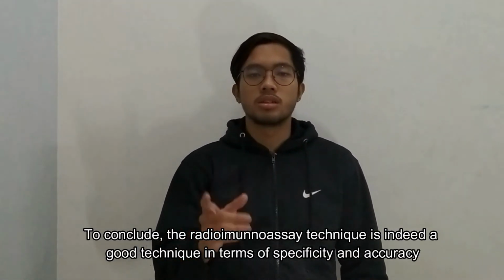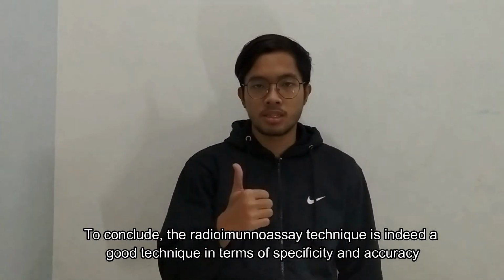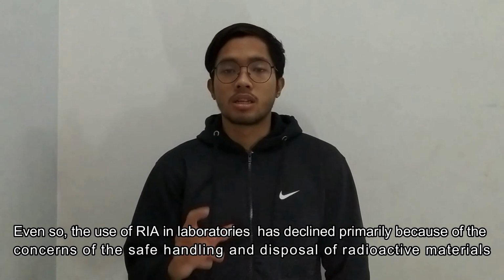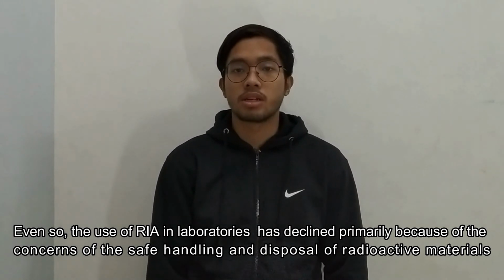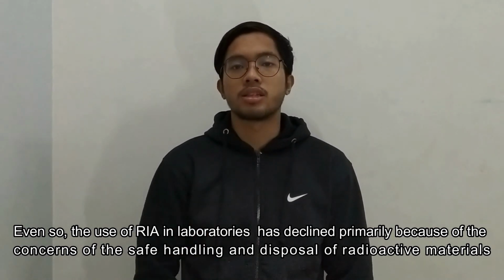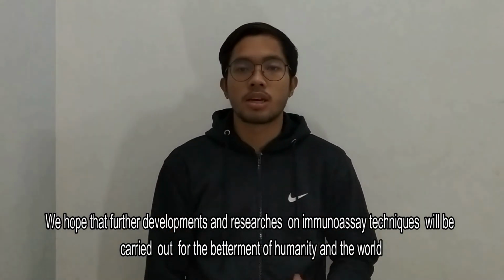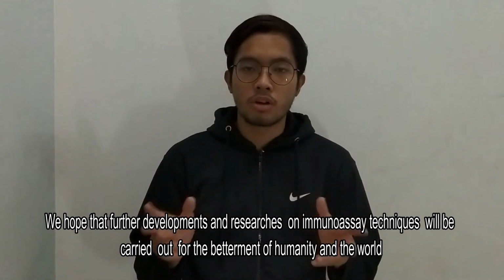Moving on to the next point. To conclude, the radioimmunoassay technique is indeed a good technique in terms of specificity and accuracy. Even so, the use of RIA in laboratories has declined, primarily because of the concerns of the safe handling and disposal of radioactive materials. We hope that further developments and research on immunoassay techniques will be carried out for the betterment of humanity and the world.